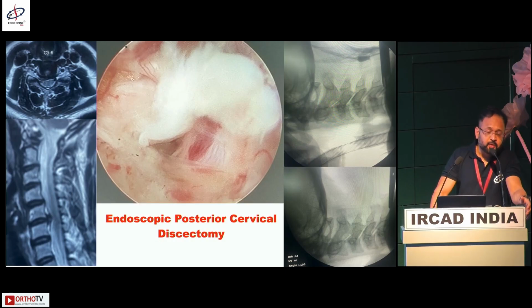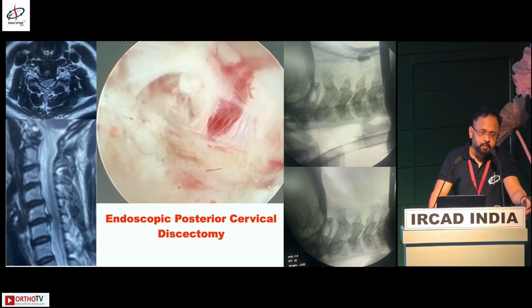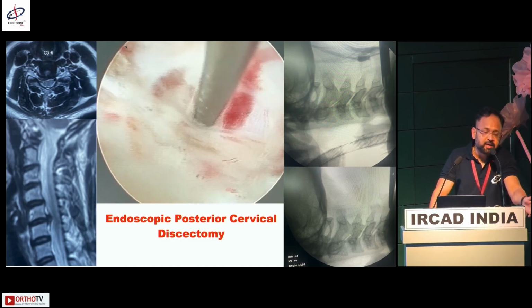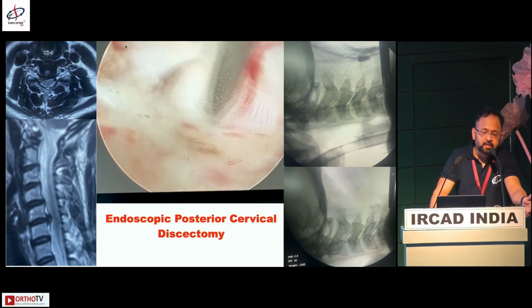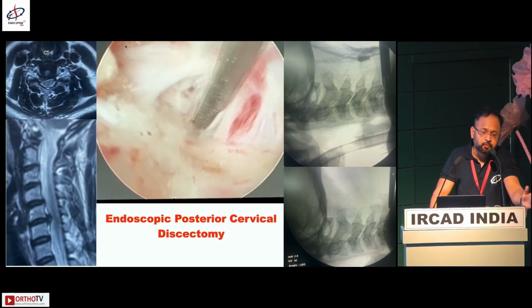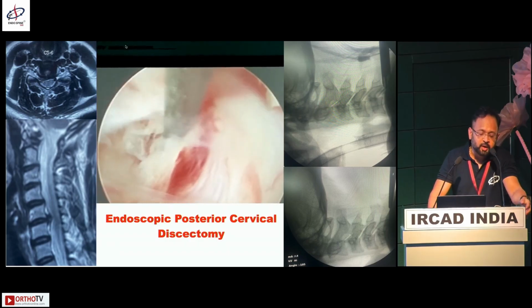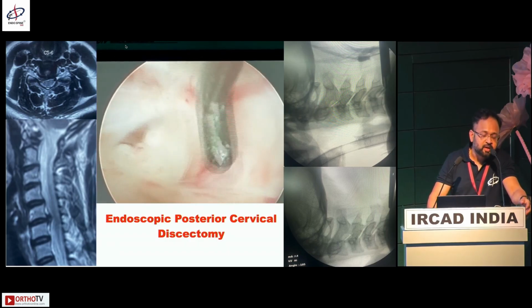The perception of cervical spine surgery has completely changed with endoscopic surgery. All the posterolateral herniations can be well tackled, and cord manipulation is not required, because ACDF is an indirect decompression. Though it is a central disc removal, just breaking the uncovertebral joints may decrease the foraminal stenosis, but it is indirect.